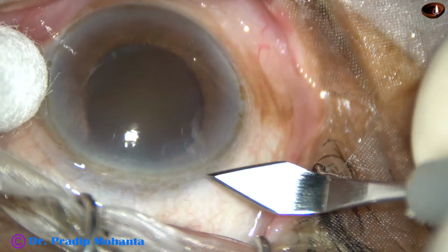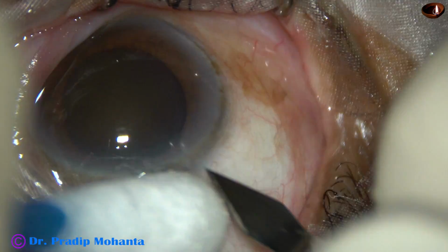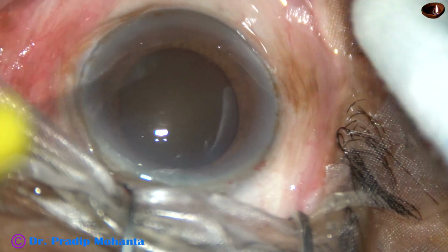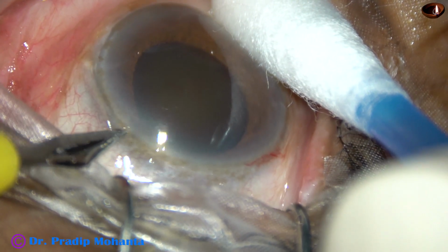This is a very hard cataract. Nuclear sclerosis in this case is about grade 6. And this is a totally unedited surgery. And you can consider this is a live surgery for you.